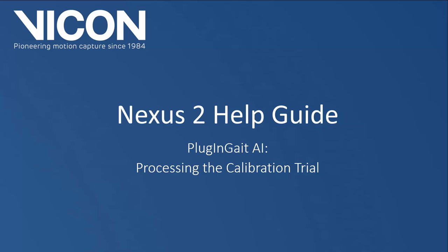Welcome to the Nexus 2 help guide. This session covers capturing, calibrating, and processing a calibration trial when using the Plug-in Gait labeling template and biomechanical model.